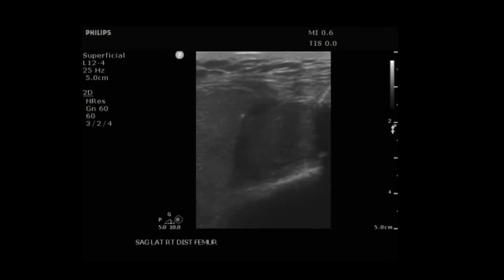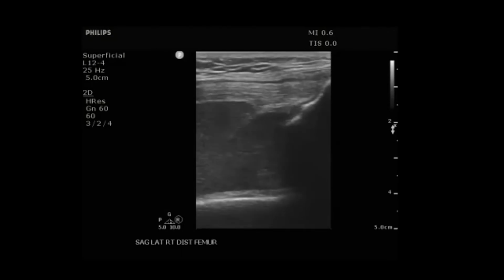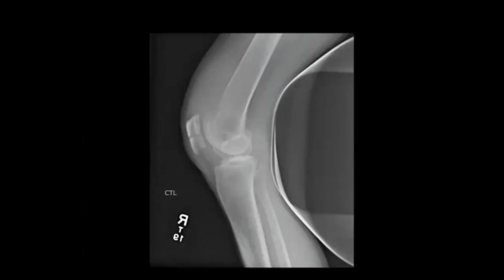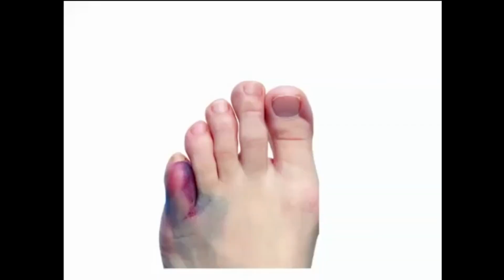And I cannot find the other video that goes with this, which shows the actual patella. So I'll have to provide you, of course, with the radiographic image. So you can see that there's actually a tear in the patella, which resulted in this very nice hematoma that you can see in the joint space. This is the toe. Well, actually, this is just an image.